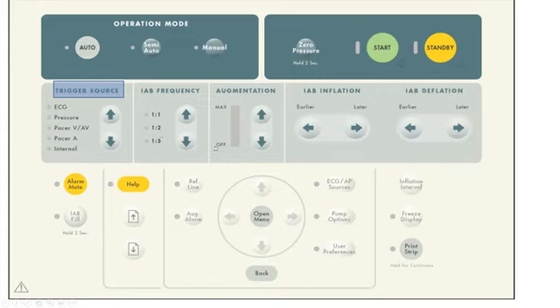And this is how on that console you can manipulate the frequency. You can go from 1 to 1, 1 to 2, 1 to 3. And you can adjust the timing of inflation if you don't like it. If you think the balloon is inflating too early or too late, you can make adjustments. And I will explain those a little later.